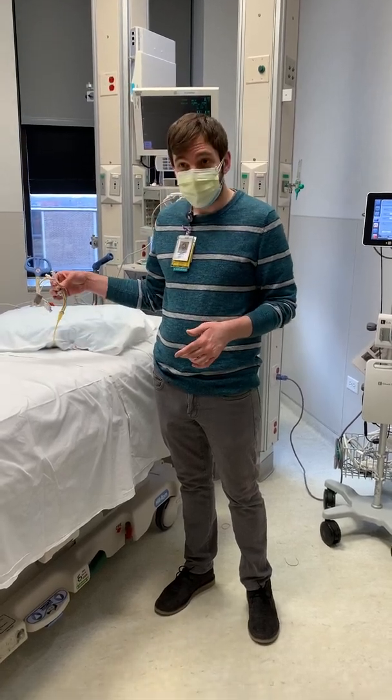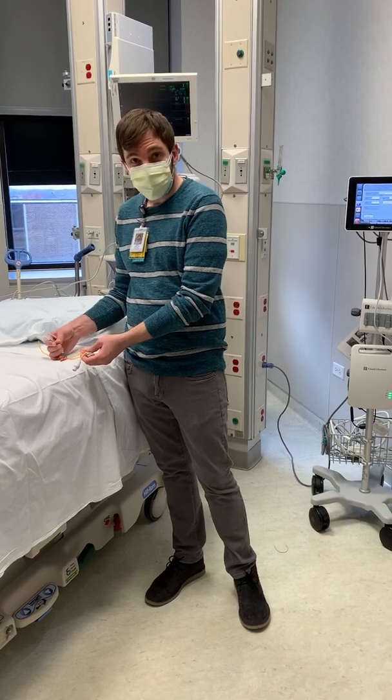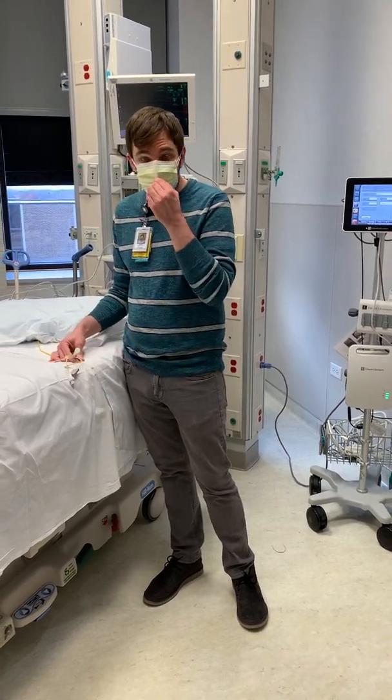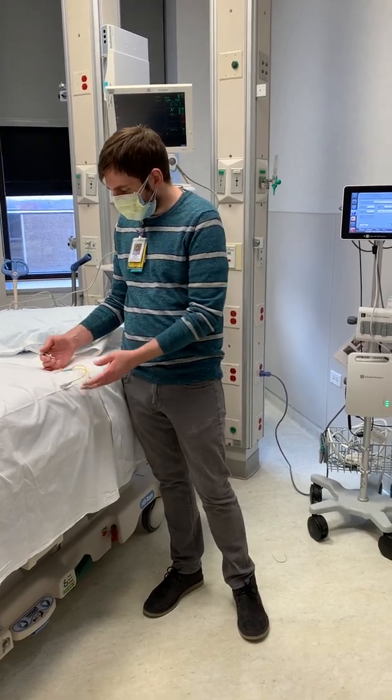We're going to talk about how to set up the Swan-Ganz catheter, or PA catheter. If you were ever to receive a patient with a Swan that had not been already set up, it's pretty easy, but confusing if you've never done it before.